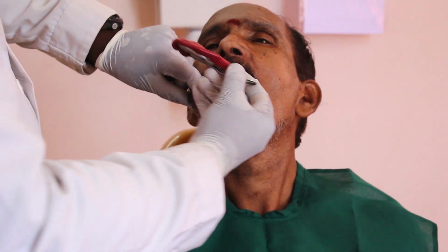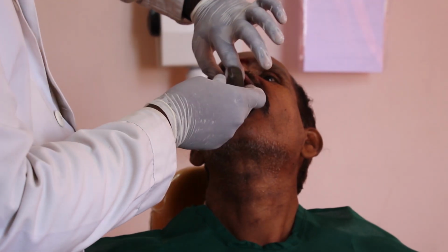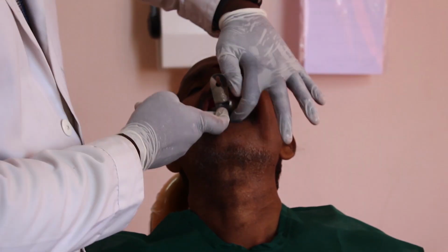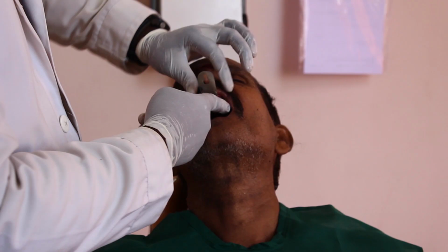So as I mentioned, we have to reflect the cheeks with the left hand on the right side of the patient, and then you have to rotate this impression tray into the patient's mouth, and you have to center it on the alveolar ridge. So after placing it inside, you have to apply the seating pressure.